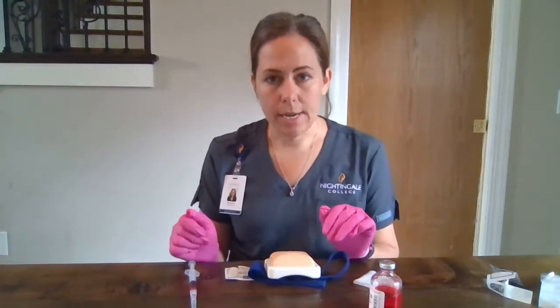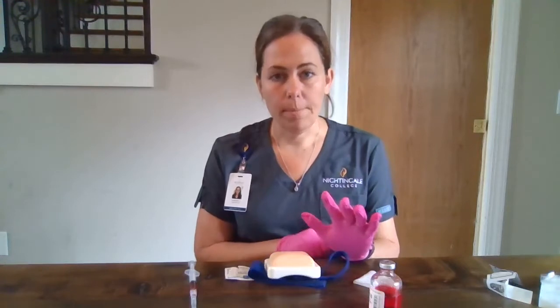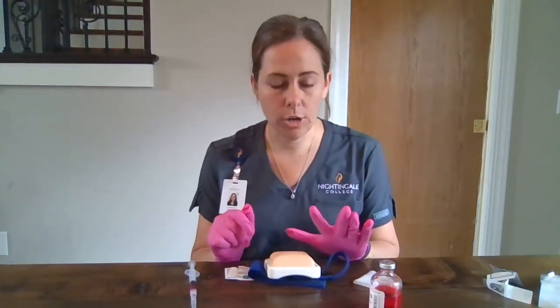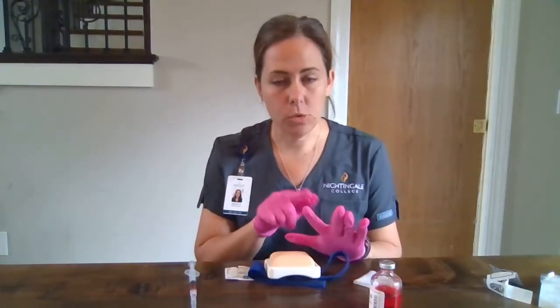We're going to select our appropriate site. So we'll have our patient lay supine or lateral. We're going to select our site. Today will be the ventrogluteal site. We'll put the heel of our hand on the greater trochanter. Make sure that our wrist is almost perpendicular to the femur. Point our thumb towards the patient's groin. Extend our fingers up along the iliac crest. Our site is going to be the V between our index finger and our middle fingers in that iliac crest.